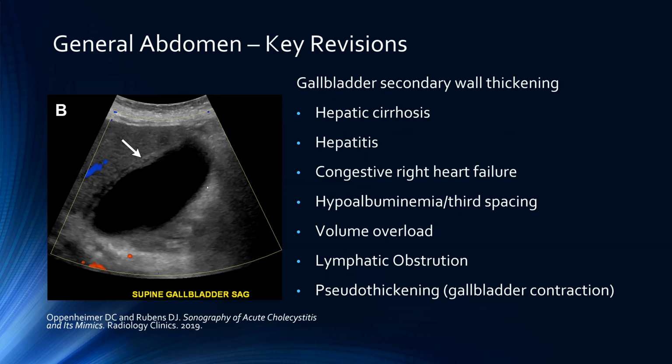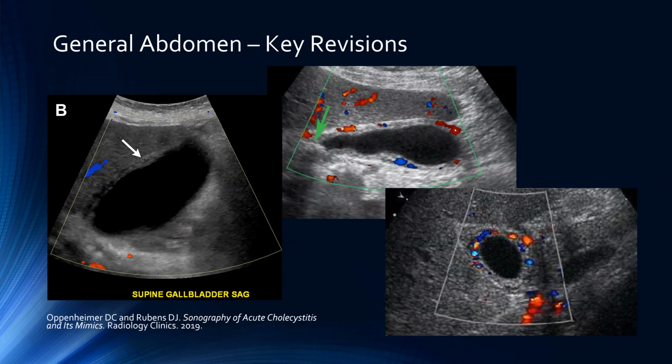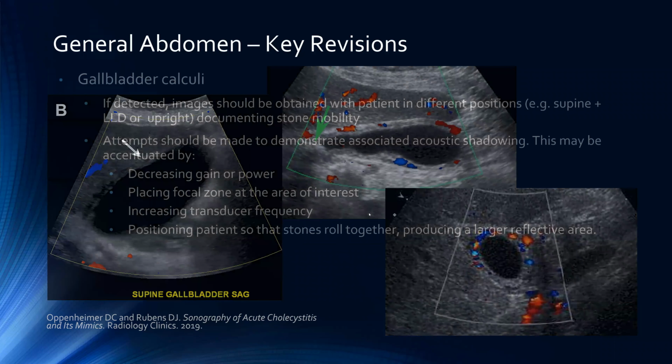completely sufficient. So here you can see, by comparison, these two cases of acute cholecystitis. On the right, the wall is thickened and indeed hyperemic, and there is some hyperemia also in the adjacent hepatic wall.